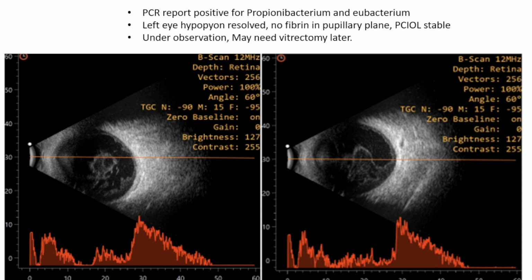Ultrasound gives you a guide. So when you're not able to see clearly, it can tell you what is going on inside and helps you to decide the treatment. But the clinical picture is also very important. You always correlate the ultrasound with the clinical picture.